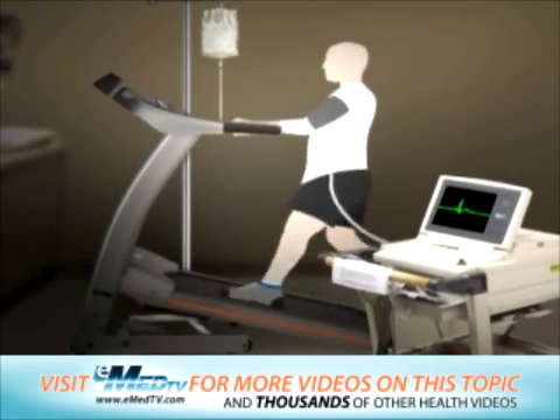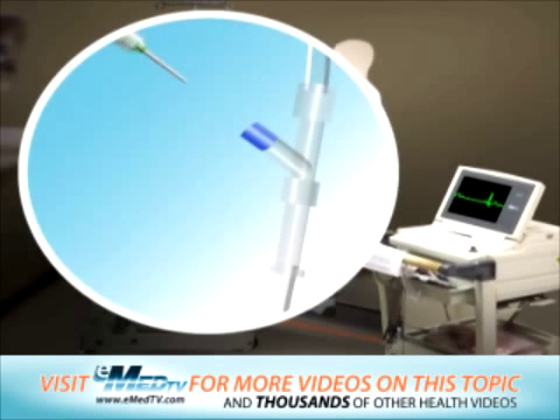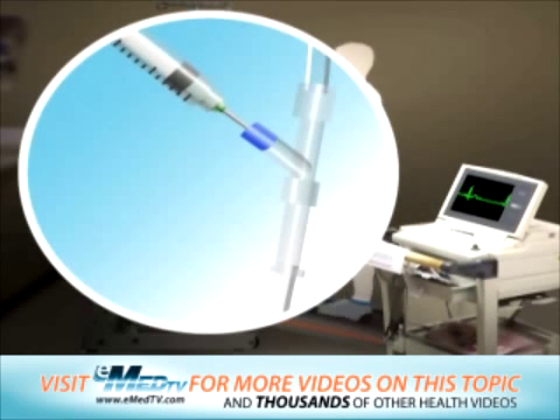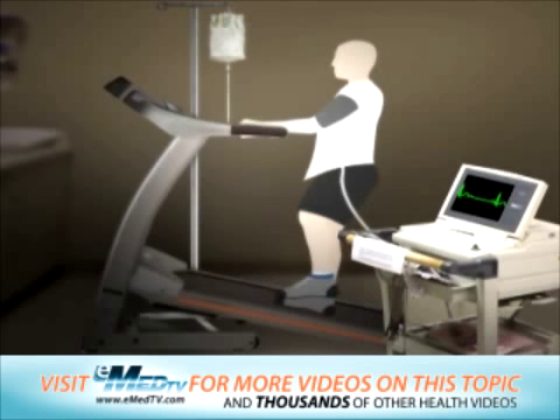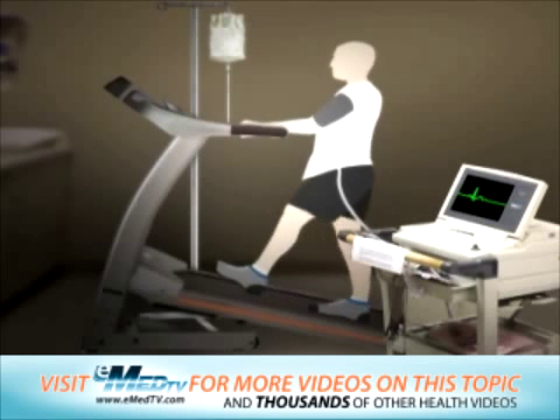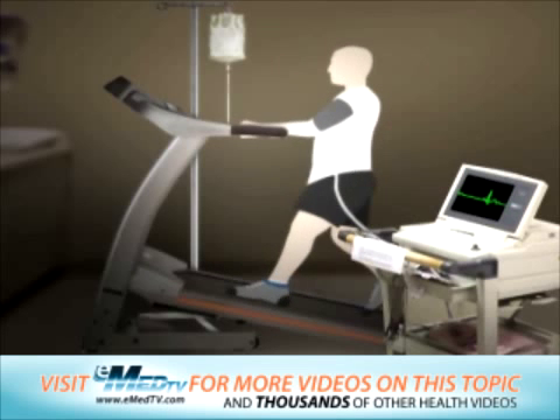This is because a radioactive tracer needs to be given through your IV one minute before the exercise is stopped. The tracer attaches to muscle cells in your heart, making them show up on the imaging camera.